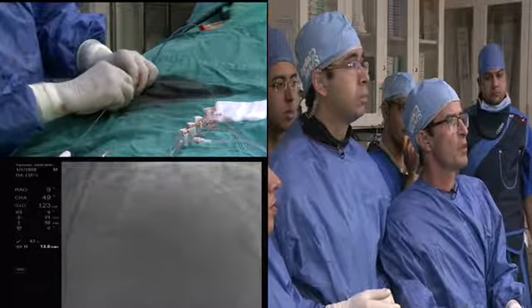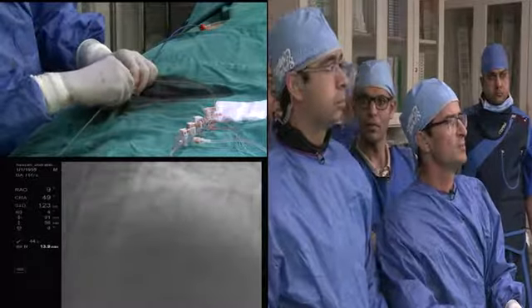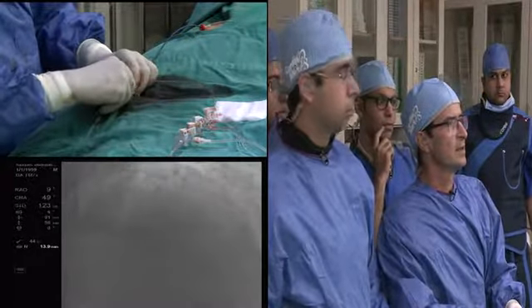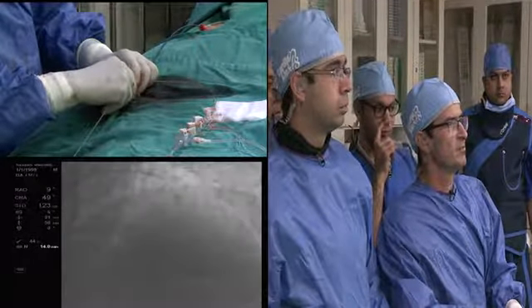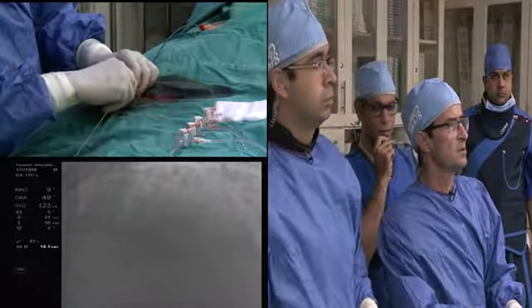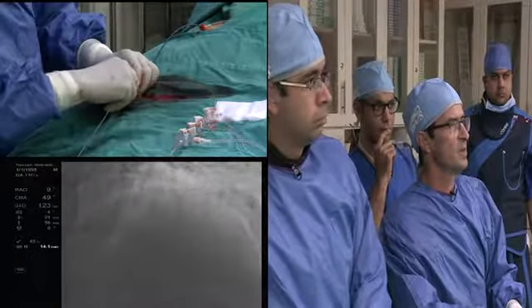Be careful with the wire, please. Wonderful. Okay, be careful with the wire. Be careful because no, don't. Push the wire, please. I don't want to lose my wire.